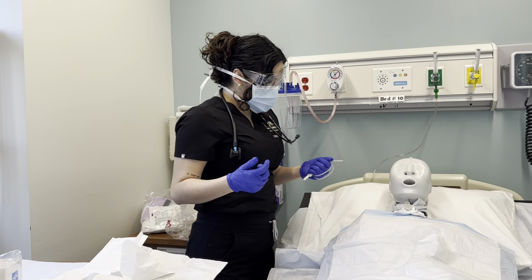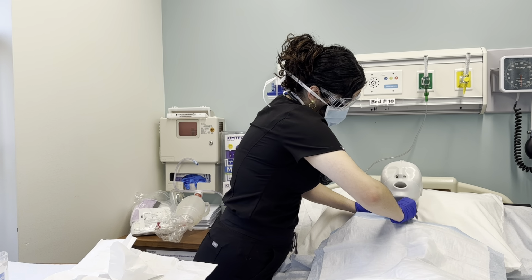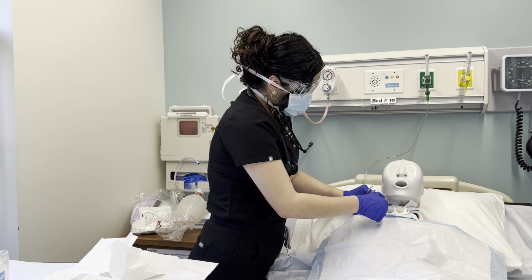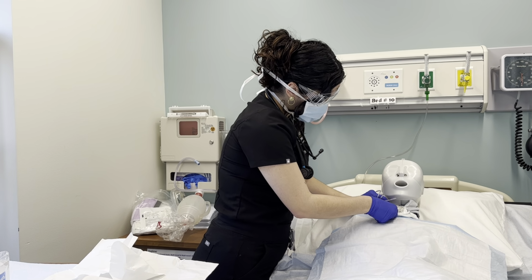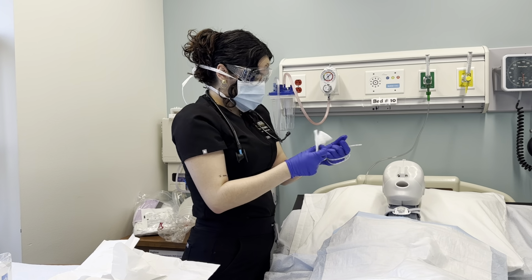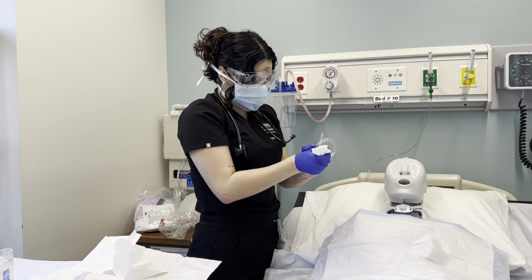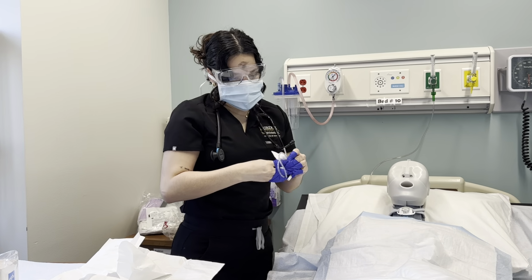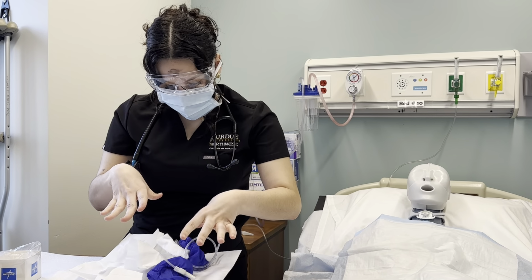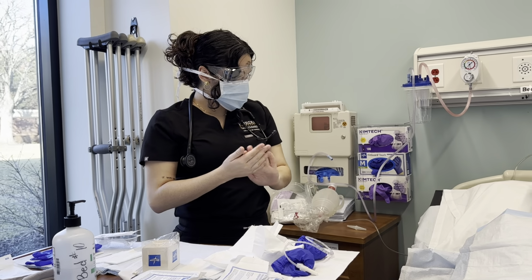And at this time, I would also unclamp the trach and remove the dressing. And dispose of all of this inside my gloves. So for the purpose of the video, I'm just going to set it off to the side. Perform hand hygiene.